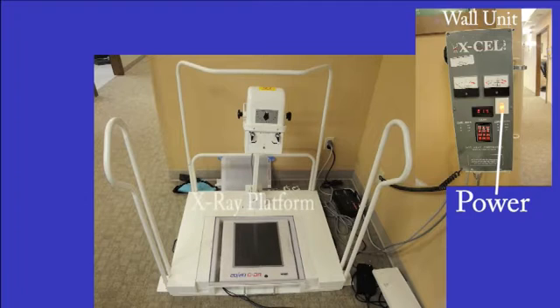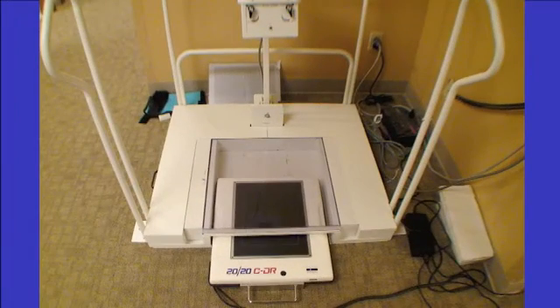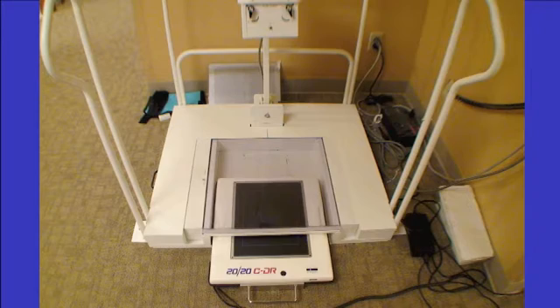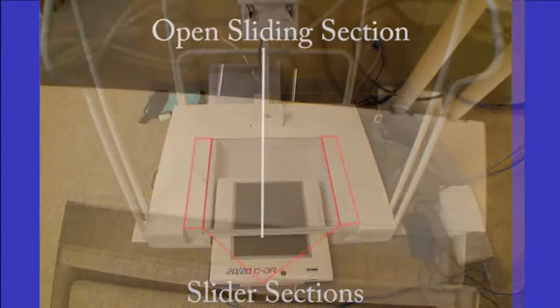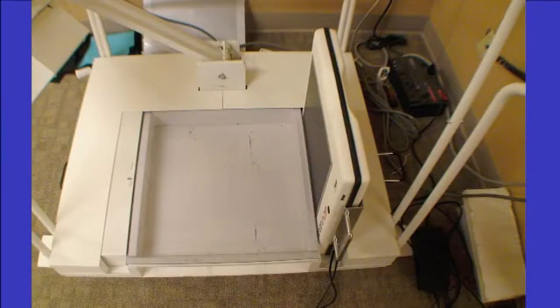The X-ray platform is set up so there is a digital cassette attached to it. It has two different placements. The first is a see-through portion of the platform, which the cassette can be slid under to take your AP and oblique foot views. The second is either side, which has slider sections that open to create a slot where the cassette can be loaded into sideways to take all of your ankle shots and lateral foot view.